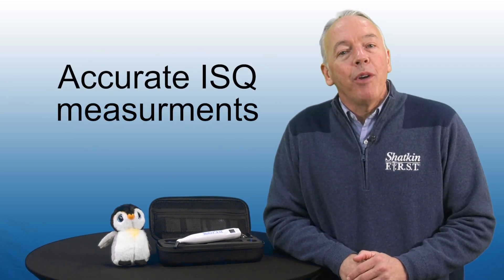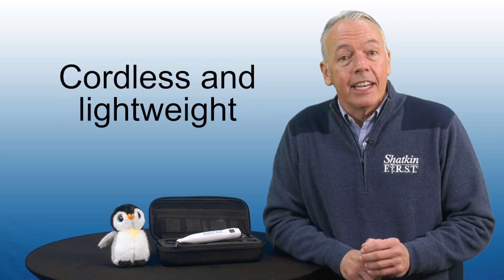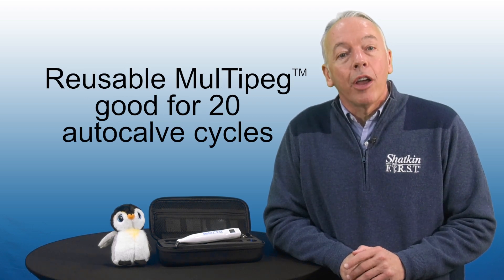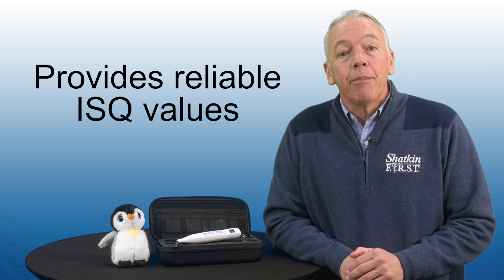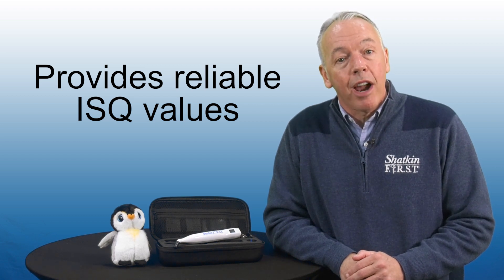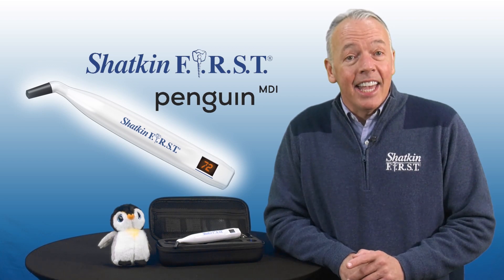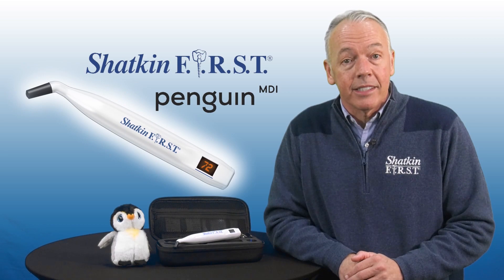The Penguin gives you accurate ISQ measurements. It's easy to use, cordless and lightweight. The reusable multi pegs are good for 20 autoclave cycles. Knowing the ISQ value and keeping that information in your patient's chart is a valuable way to track your mini dental implant patient's progress using numerical values. And it's the only ISQ device available for mini dental implants with OBAL abutments.